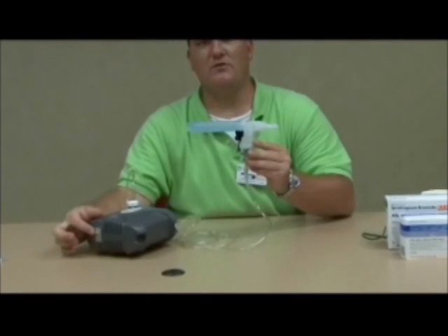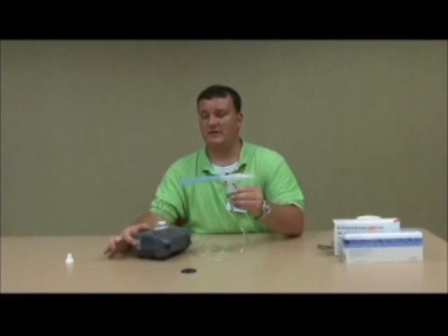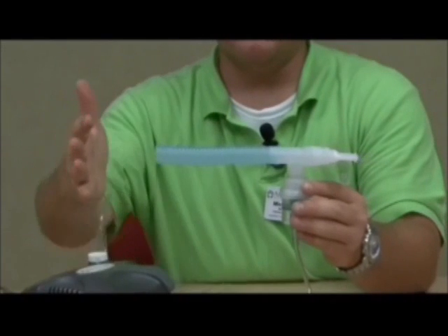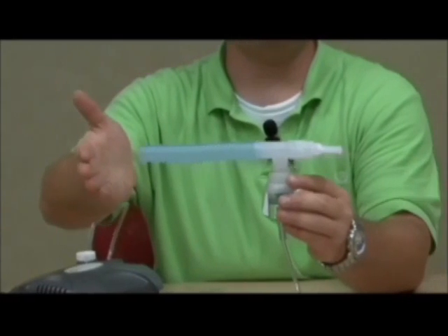Once you have put your nebulizer kit together correctly and have medication in there and are ready for your treatment, you will need to locate your power switch on the side of the nebulizer. Flip it up into the on position, place the mouthpiece in your mouth, take a breath and hold it for five seconds and release. The typical treatment should take about ten to fifteen minutes. I'm going to turn this on to demonstrate what it should look like and sound like. As you notice, there is a mist or fog that forms — this is what you should see while doing your treatment.